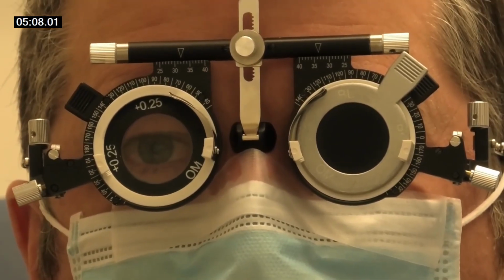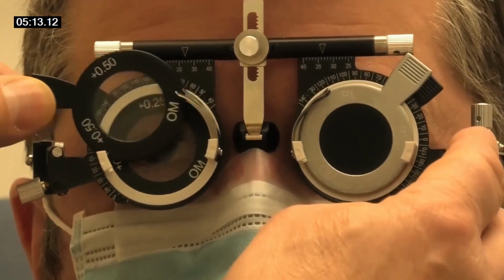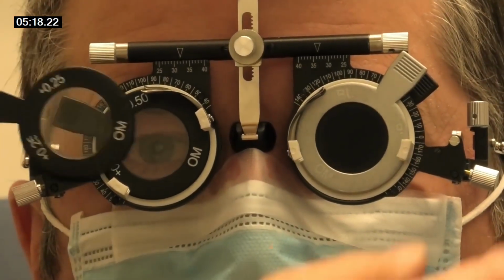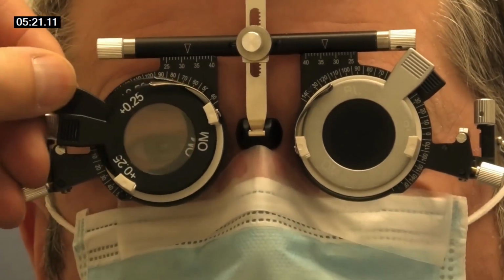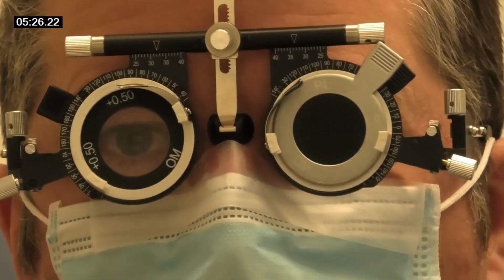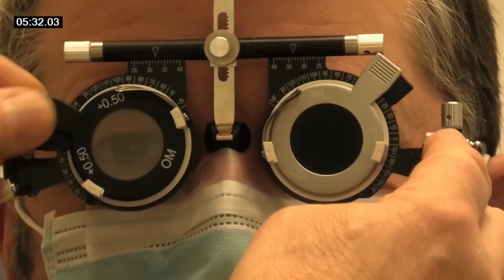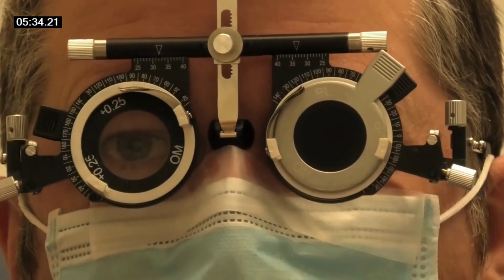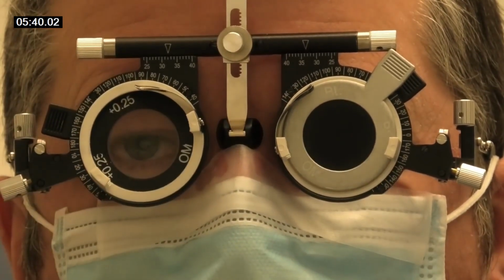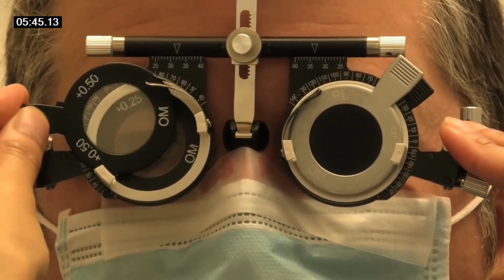But what you normally do with these plus lenses when they're long-sighted like this, you normally put one lens in like this, put one in like that, then you take the back one out, you put it in like that, then you take that one out, put it in like that, and then you do it like that. Okay, and that then is always a bit blurred. So if I put it back in, there we go. No, you've got to change it. I've changed it back. I did it on purpose. So you can practice it. That's it. There you go. So that's it.